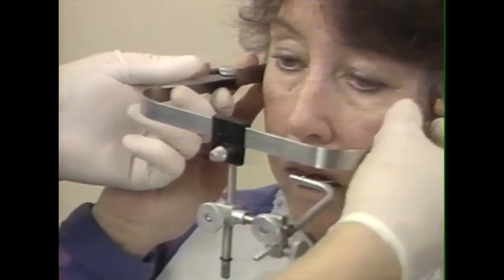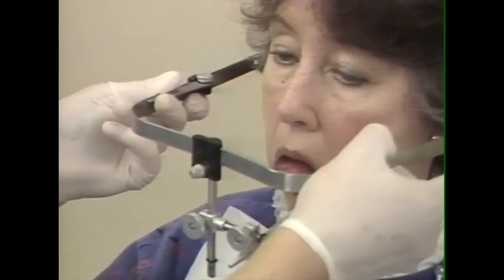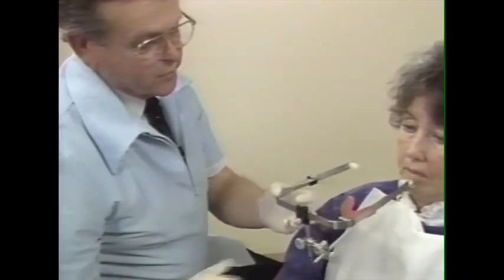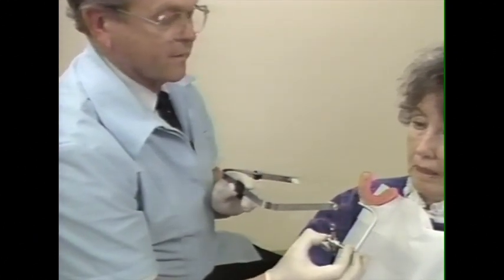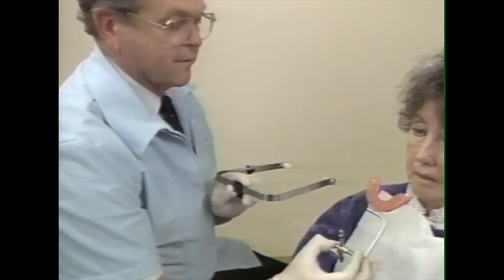We're now ready to remove the Facebow from the patient. We open, please, and slide it out of the mouth. And that completes our Facebow record. We can now remove the record from the Facebow, and this is what we use to transfer the cast to the articulator.